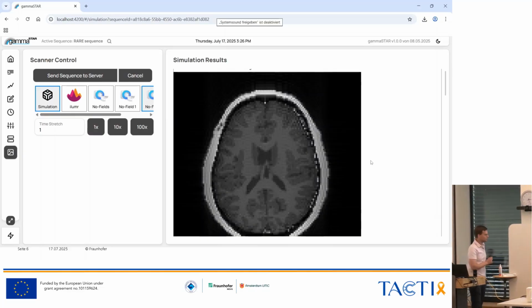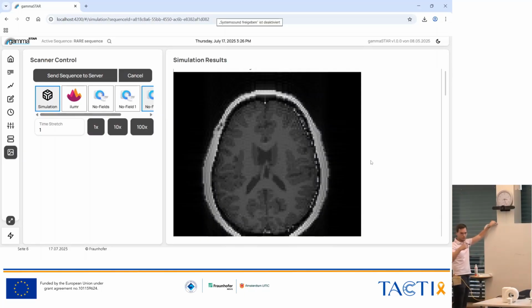And this is because if we look at, let's say, the transverse magnetization, which is 0 at the start, and with our RF pulse, well, let's say be at 100, and then it decays, and then, oh no, let's do it the other way around, let's go with the longitudinal. So we have the longitudinal magnetization in equilibrium state, we excite it, and then it's basically 0 with a 90-degree excitation pulse.